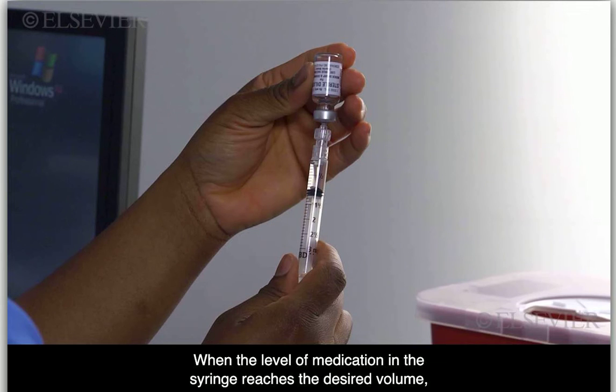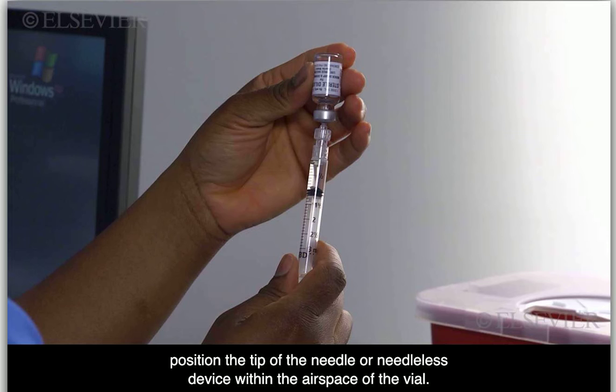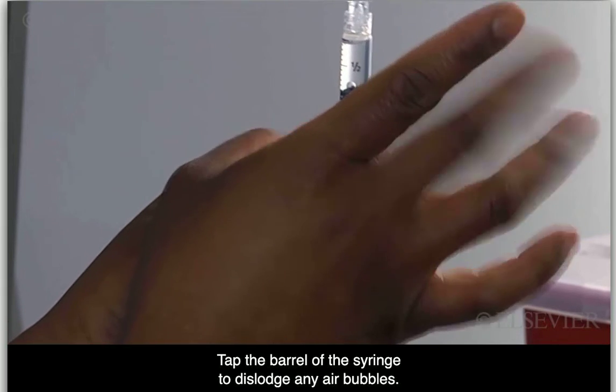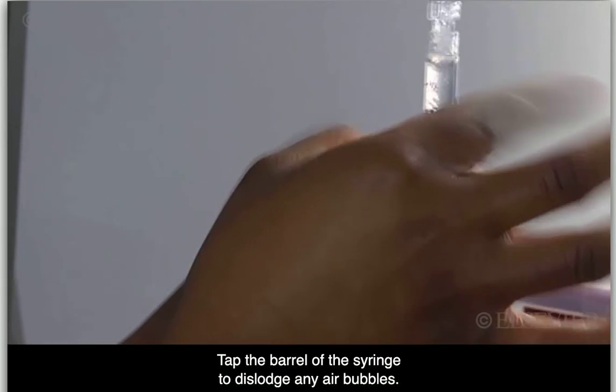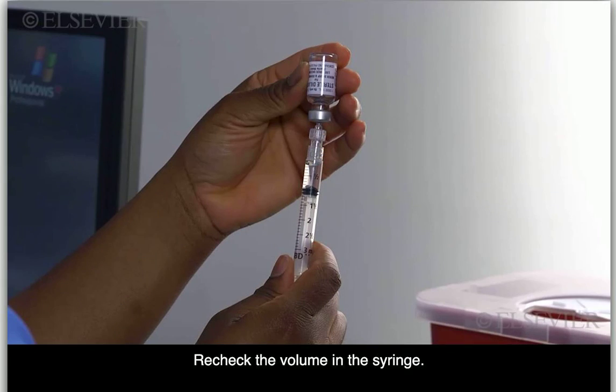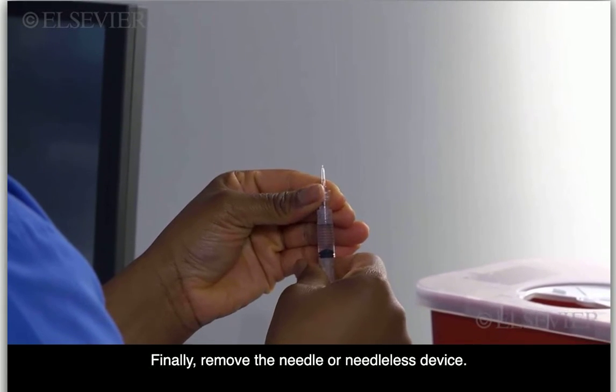When the level of medication in the syringe reaches the desired volume, position the tip of the needle or needleless device within the airspace of the vial. Tap the barrel of the syringe to dislodge any air bubbles. If air remains at the top of the syringe, eject it into the vial. Recheck the volume in the syringe. Finally, remove the needle or needleless device.